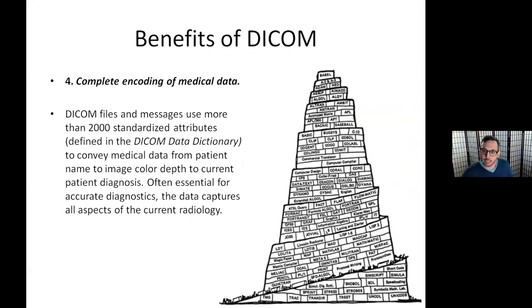I've hit this again and again, the ontology earlier. This is kind of a picture of the Tower of Babel. When everybody could speak the same language, DICOM allows that. With the data dictionary, with the shared language, we can communicate. We can communicate across the world. And really that makes us stronger and more powerful.